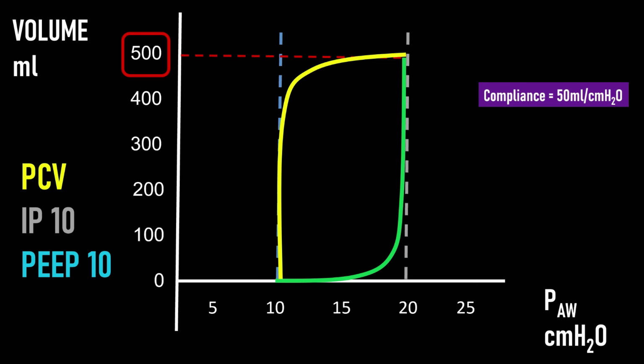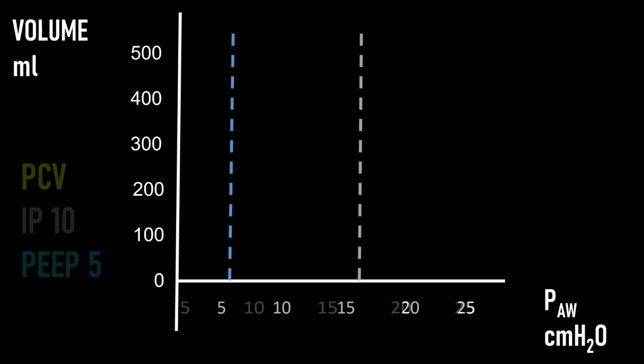And the reason why the compliance is better for the same driving pressure is because the PEEP is pushing that patient with 15 centimeters of water of PEEP above the P max on the volume pressure curve. So coming down to 10, we are now certainly between the P flex and the P max. Now let's drop the PEEP down to 5.